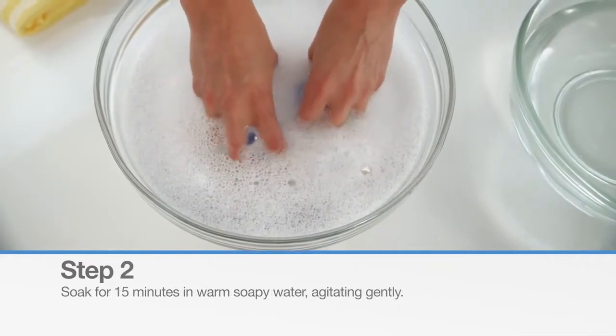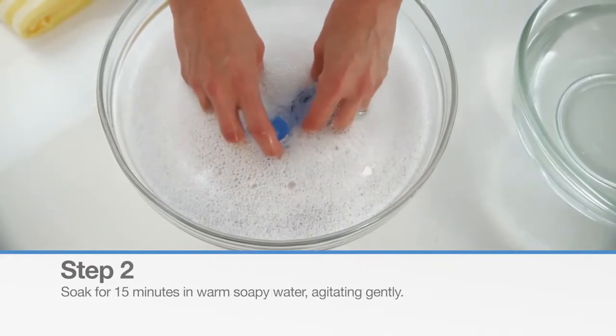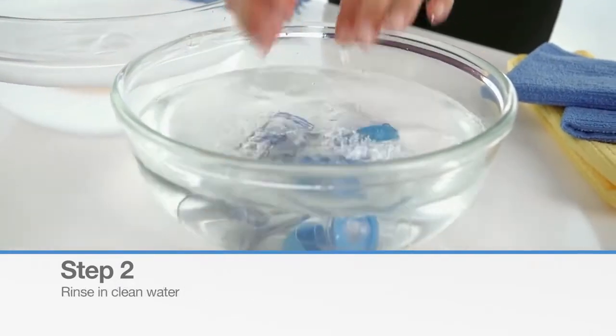Next, soak all three parts in warm soapy water for 15 minutes, agitating gently. Rinse the parts in clean water.